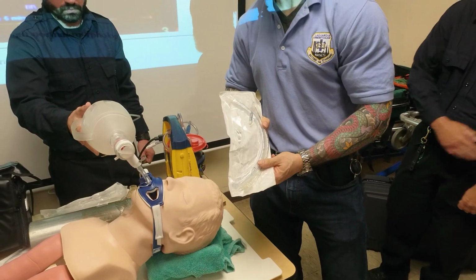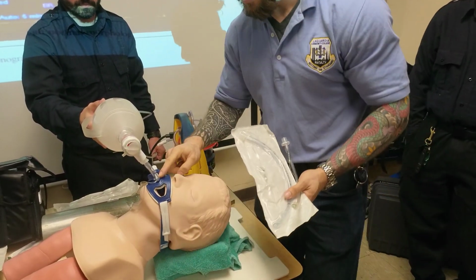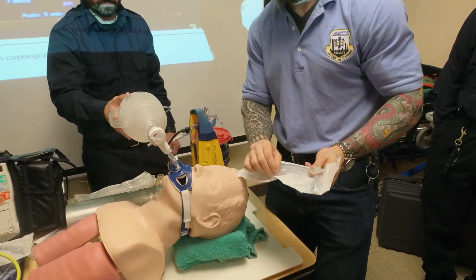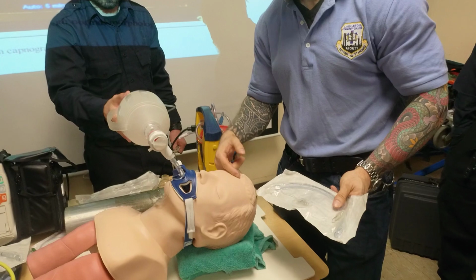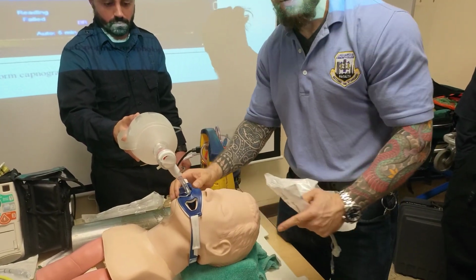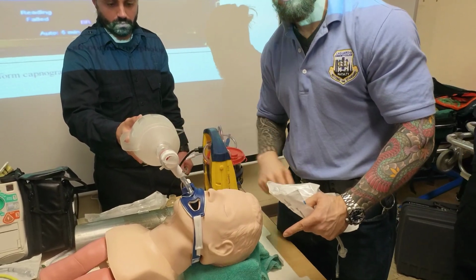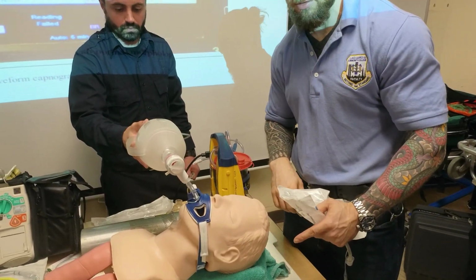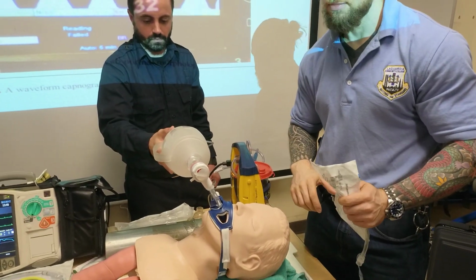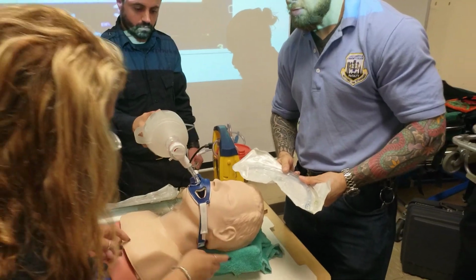Couldn't you also mark the tube of where it's at? Can you mark it? Right, I hold it at 23. You're going to document on your ACR. But when I go back, let's say this was cardiac arrest, firefighters bring them down, I open this up, I recheck everything. At the lip line, end-tidal CO2, pulse ox, lungs, everything. Any movement, I recheck everything. I print the strip.